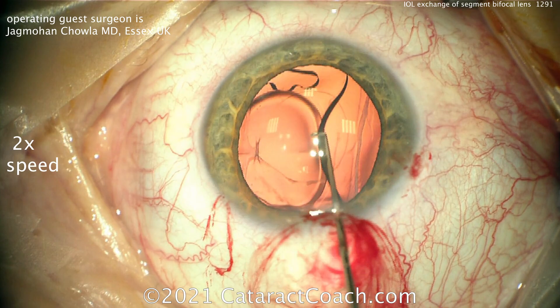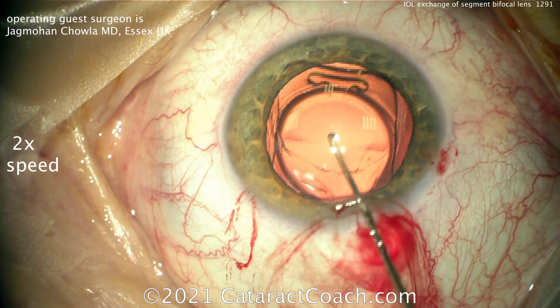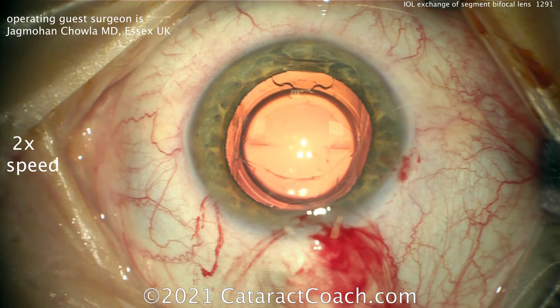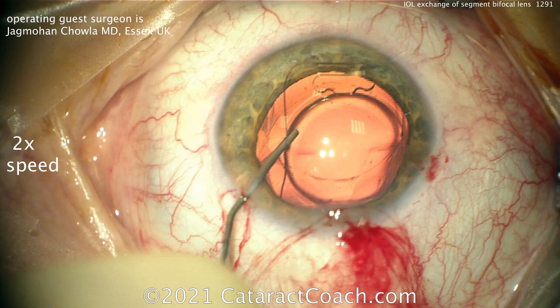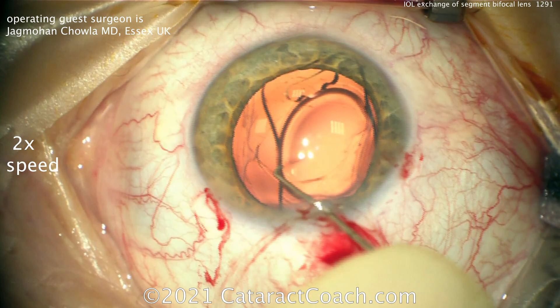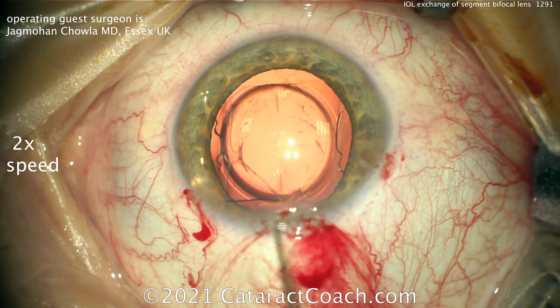Now that you have that cushion of viscoelastic behind it, he can bring that lens up. Maybe it's a silicone lens or a hydrophilic acrylic — it looks very soft and very flexible, without the typical rigidity of a hydrophobic acrylic we tend to use in the US. This is the M Plus Lentus lens; we don't have this in the US and it's interesting to see it. Despite having no diffractive rings, the patient still didn't like the resultant nighttime vision. Very carefully getting it out of the capsular bag, using a two-handed technique.